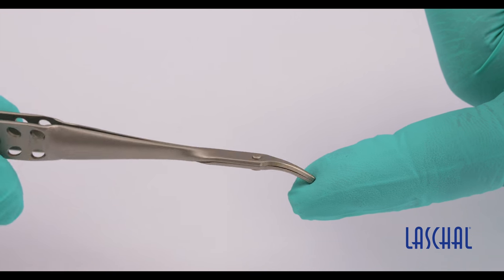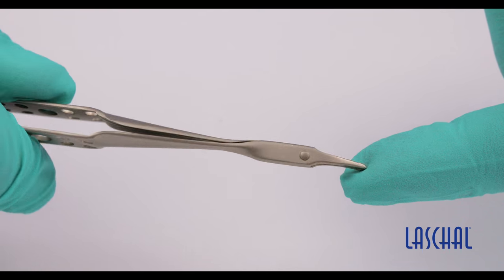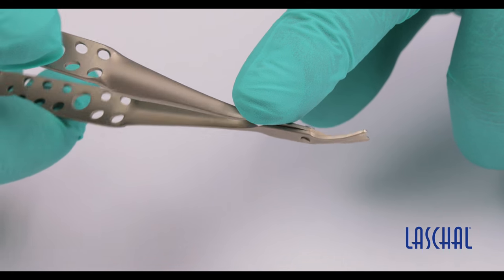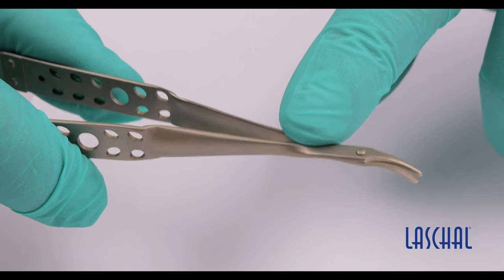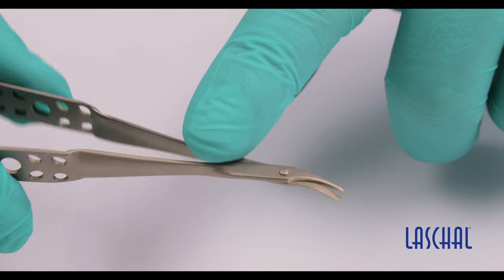In these types of situations, since the scissors are designed to remain open, they can actually gently push the tissue aside, only cutting the suture, again leaving the tissue unaffected.